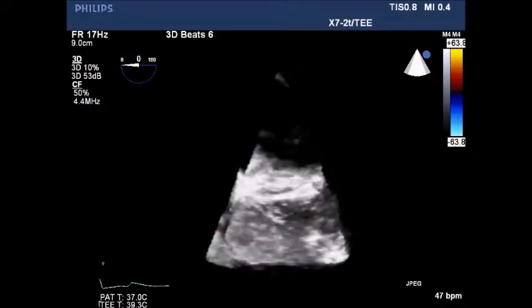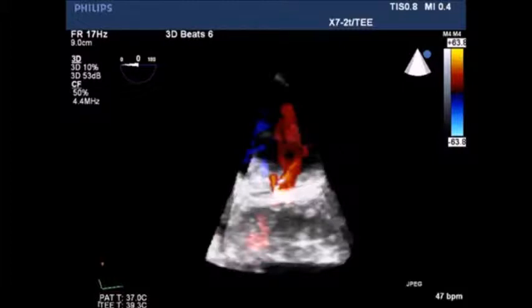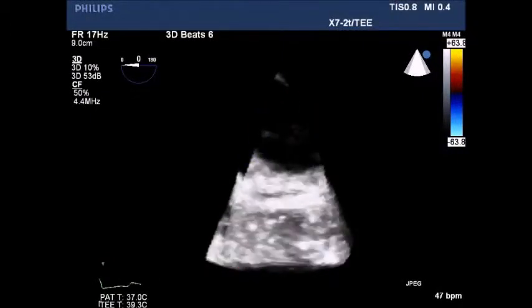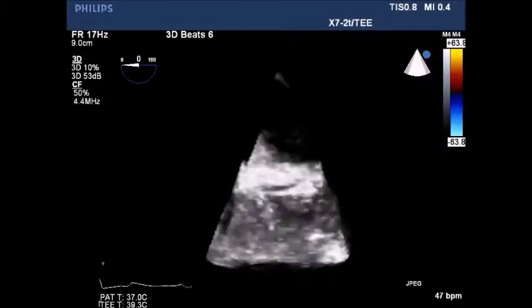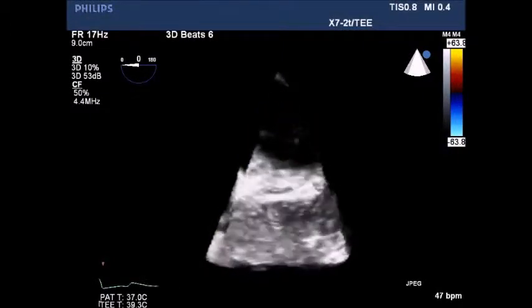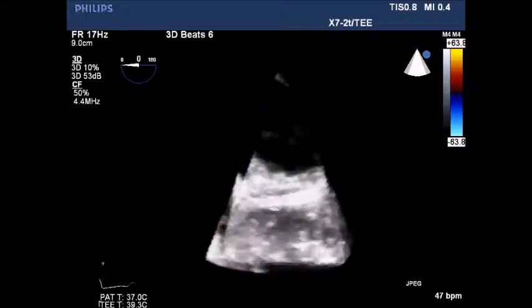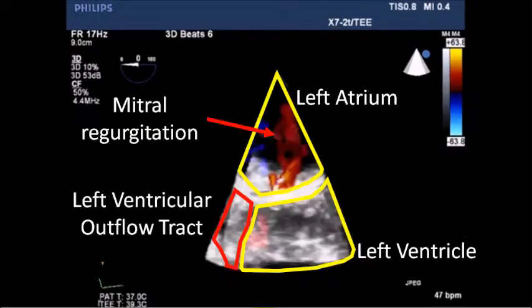The image has been rotated to show the left atrium at the top and the mitral insufficiency jet. At the bottom, color Doppler represents flow through the left ventricle outflow tract — so a small amount of mitral regurgitation.